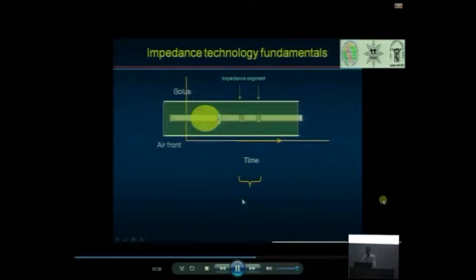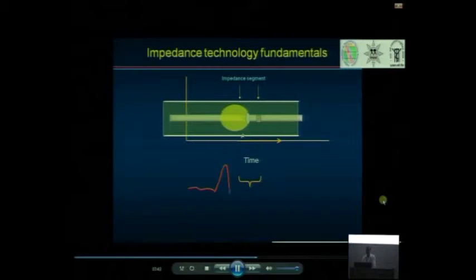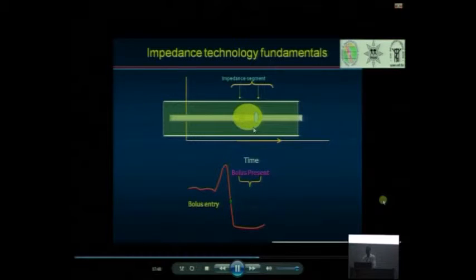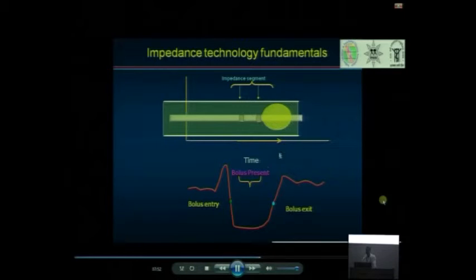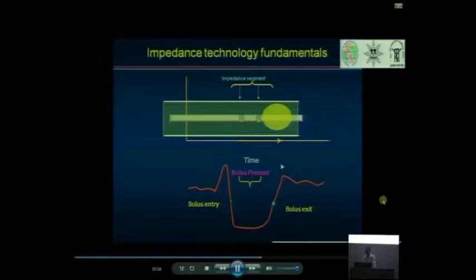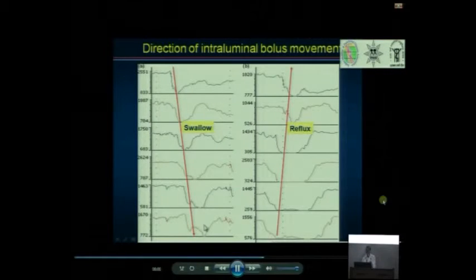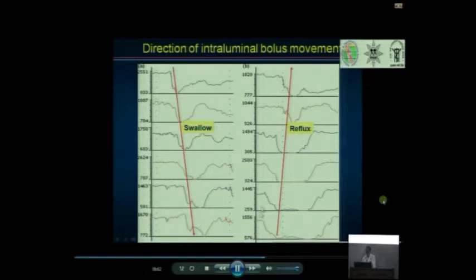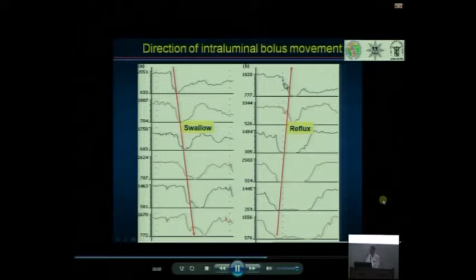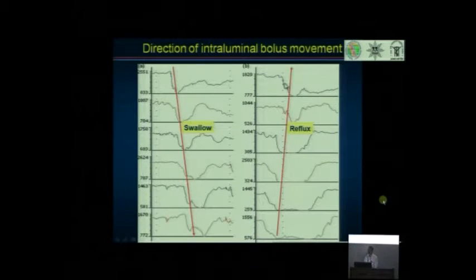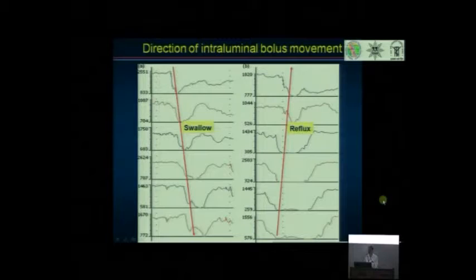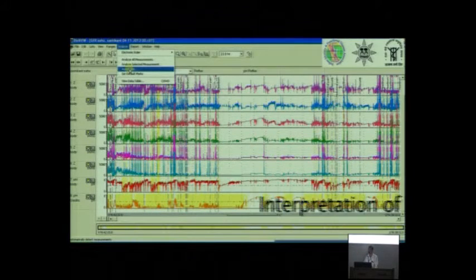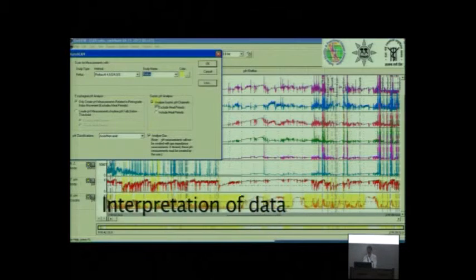I told you already the principle of impedance. When the bolus moves, there is a drop in the impedance because we know electrical current is better flown in the liquid media, and when the bolus goes out there is again increase in the impedance. Suppose such lowering of the impedance is antegrade like this, this is swallow. Whereas if the lowering of the impedance is retrograde like this, this is reflux. You can make out whether it is reflux or swallow, you can make out whether it is liquid reflux or gaseous reflux. This helps very much in a patient of belching. You can make out is it supragastric belching or gastric belching.